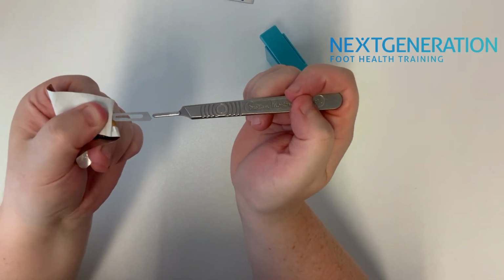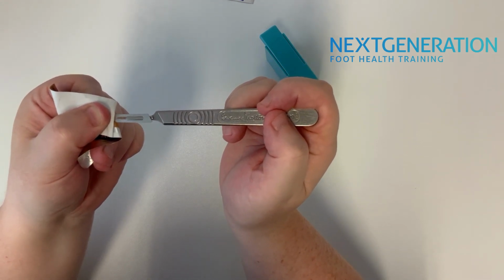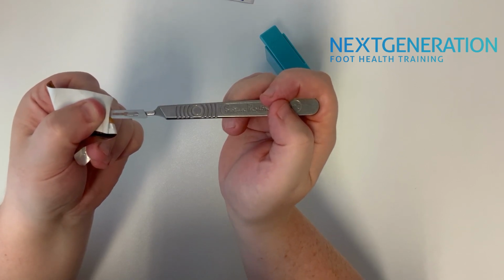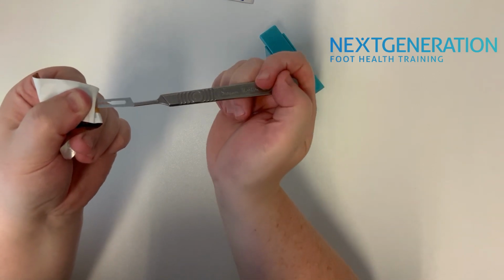What we're going to do is approach the blade from underneath through that big hole, and then we're going to bring it up parallel, and then we're just going to attach the grooves around the tip of that handle piece onto the narrow ones there. But whilst I'm doing that, you'll also see that that angle is matched up with the angle of the handle piece as well. So I'll just show you that again.